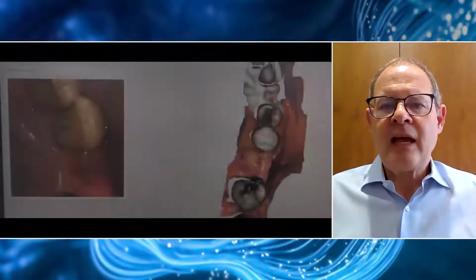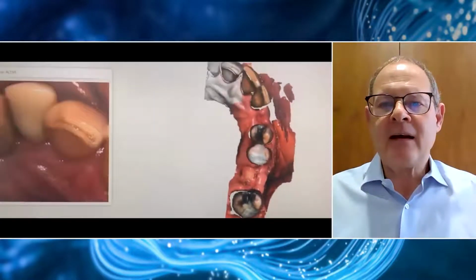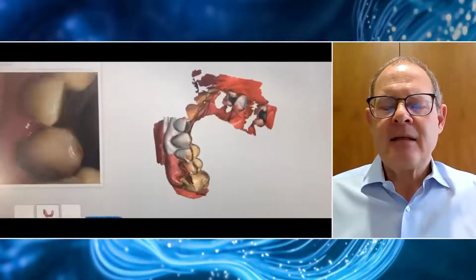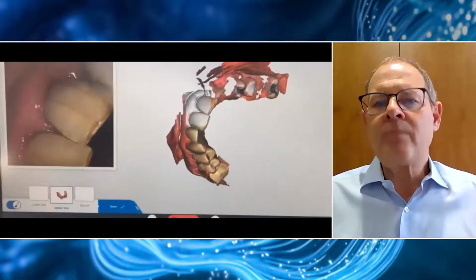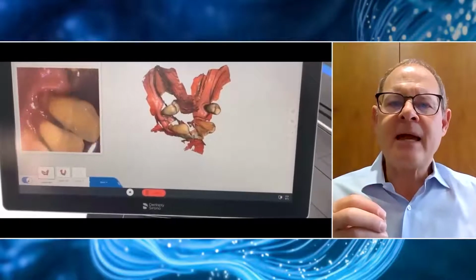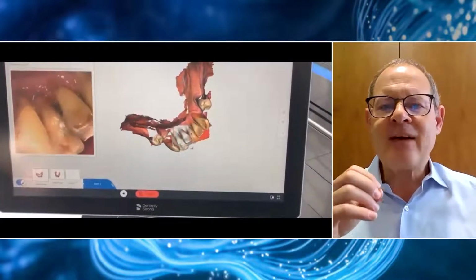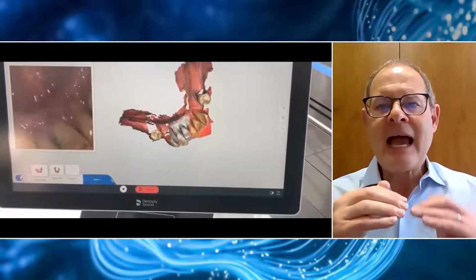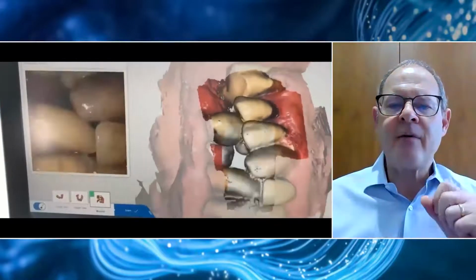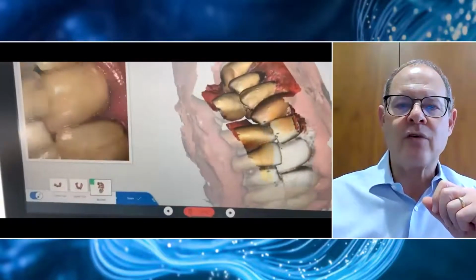Intraoral scanning, of course, has been a long-running saga in terms of technological development. And there are, of course, many options on the market for scanners. But it seems that we now have in Primescan a really state-of-the-art piece of equipment that provides phenomenal information with many tens of thousands of images captured per second at quite full depth, so that we're able to capture all of this information, including the bite registration, of course.